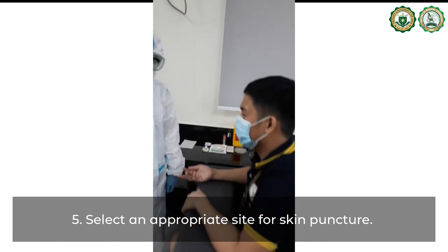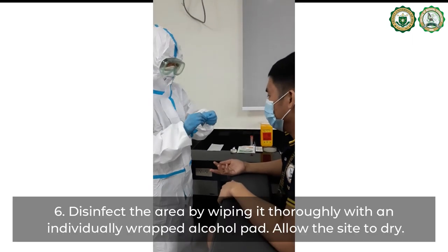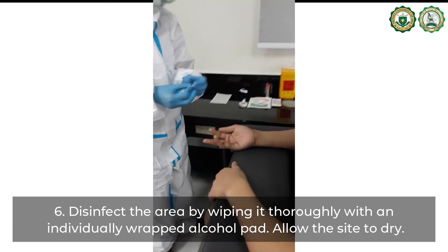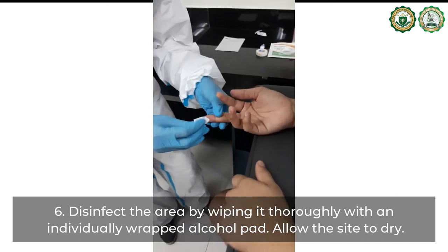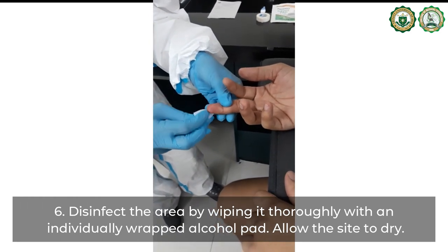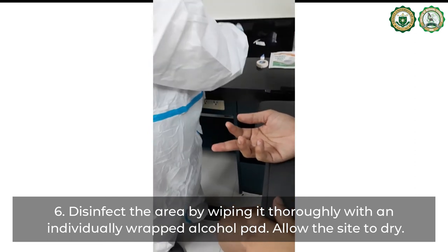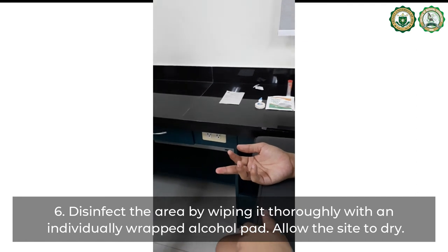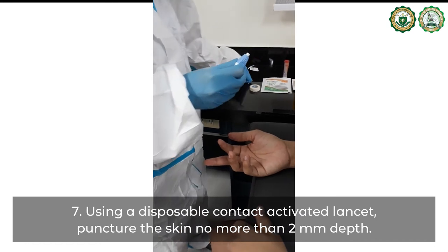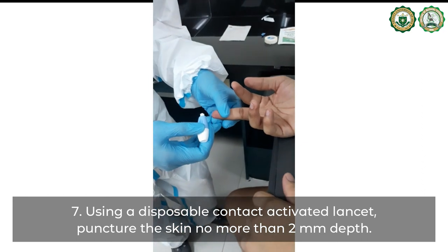Select an appropriate site for skin puncture. Disinfect the area by wiping it thoroughly with an individually wrapped alcohol pad and allow the site to dry. Using a disposable contact-activated lancet, puncture the site no more than 2 millimeters deep.